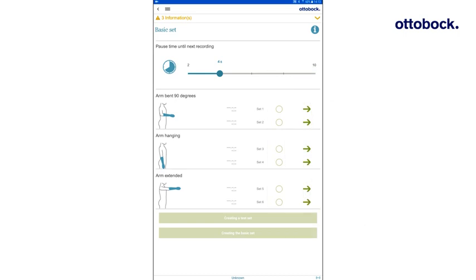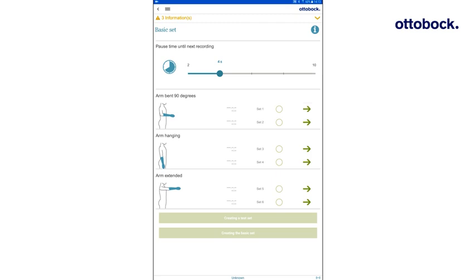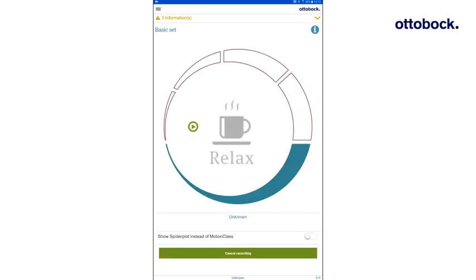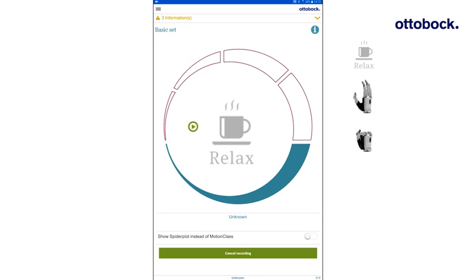To start the recording, make sure the arm is bent 90 degrees and press the green arrow next to Set 1. For each set, five movement patterns must be performed in the following order: Relax, Hand open, Hand close, Supination, Pronation.